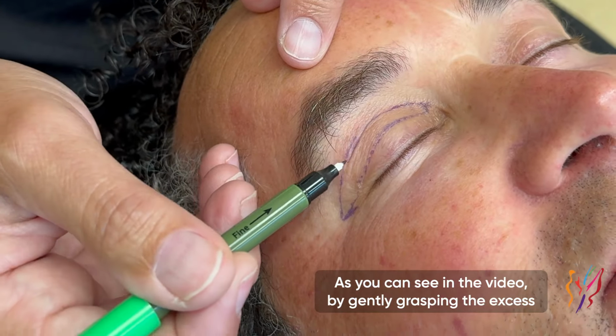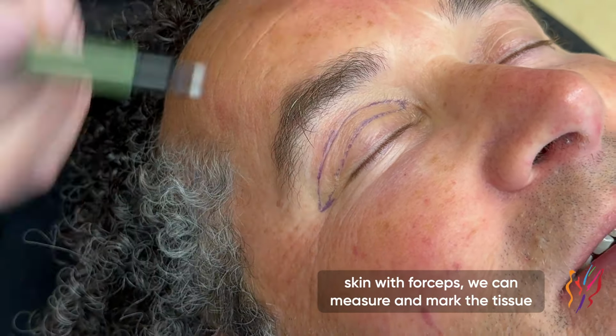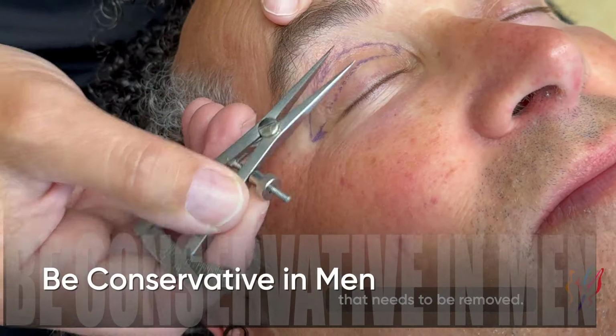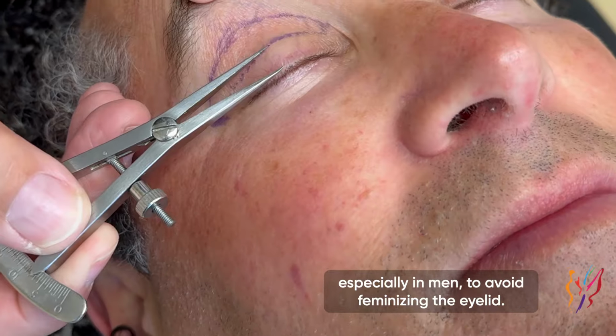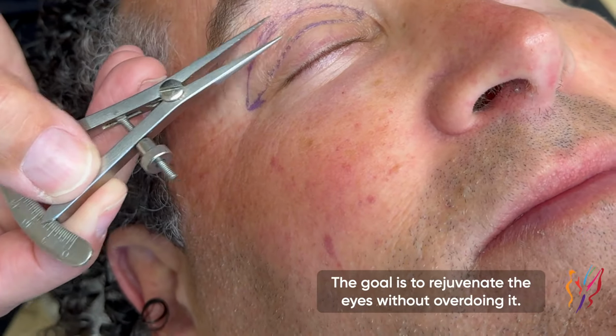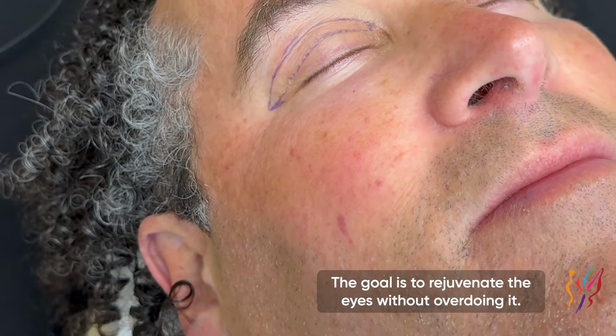By gently grasping the excess skin with forceps, we can measure and mark the tissue that needs to be removed. It's important to be conservative, especially in men, to avoid feminizing the eyelid. The goal is to rejuvenate the eyes without overdoing it.